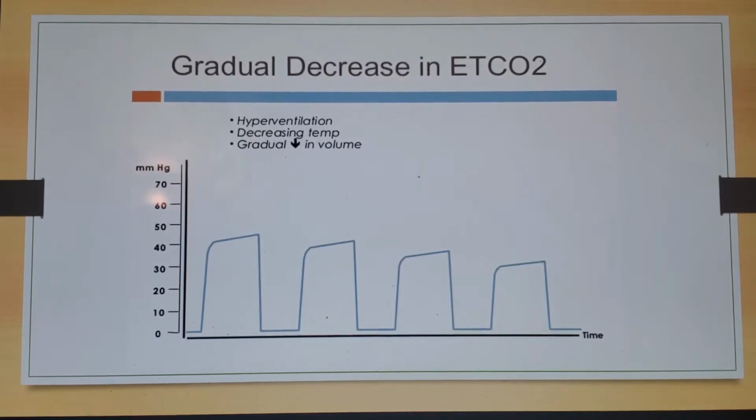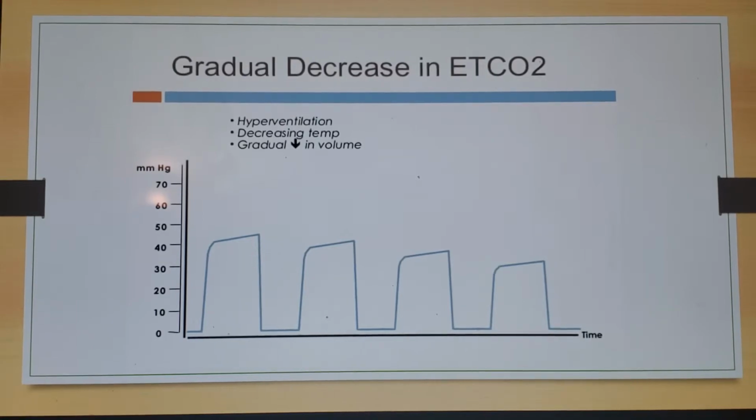Again, that's what we're talking about. And you kind of get the same thing, like say a patient with a rapid blood loss in the abdominal cavity that's getting less and less perfusion, they're going to get lower and lower end tidal CO2. So this would be a sign of a patient that's actively becoming unstable in your care.